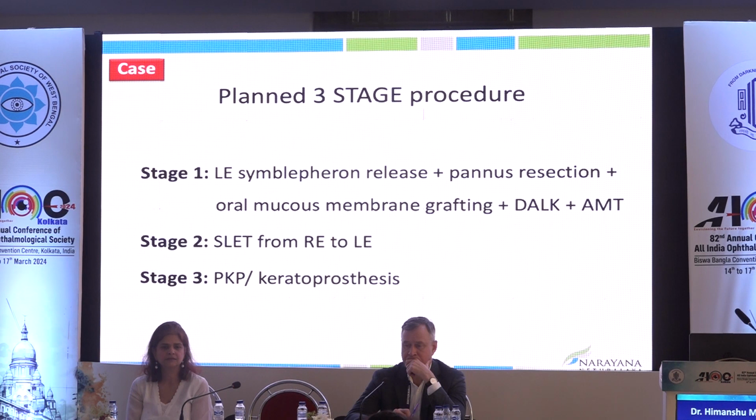So I planned a 3-step procedure. The first step was symblepharon release and pannus resection with oral mucous membrane graft, DALK, and amniotic membrane. And the second step was SLET from the other eye, and the third step PKP.